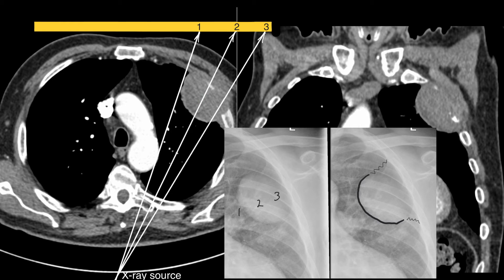And this is the incomplete border sign. It's a very important sign because it tells you that it's likely to be a non-pulmonary lesion — so it's either a pleural lesion or an extra-pleural lesion. And if you've got rib destruction, you know it must be an extra-pleural lesion. Here you can see it invading the chest wall and the rib.